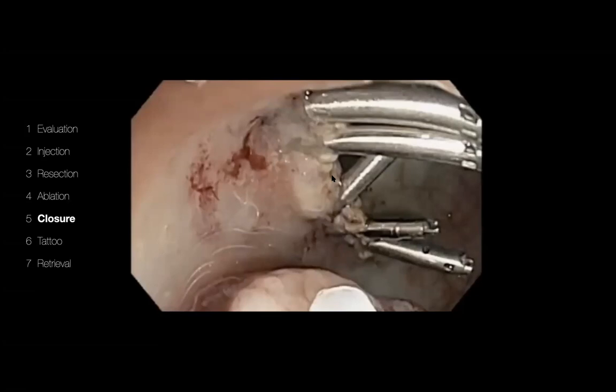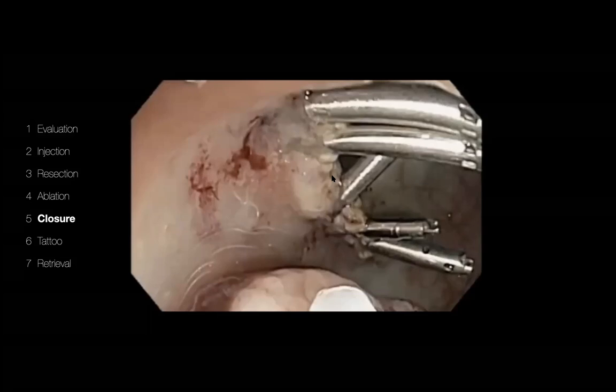But retrospectively, having learned a little more about electrosurgery and the impact of each setting, if I were to do this case today, I would use FX3 like we did before, keep the duration at 1, but increase the interval to 5 or 6, not 3. By increasing the interval to 5 or 6, I would get a lot more coagulation in between the cuts and hopefully avoid major bleeding.